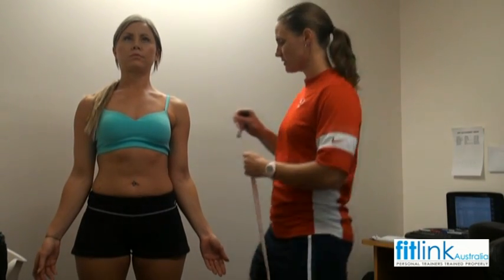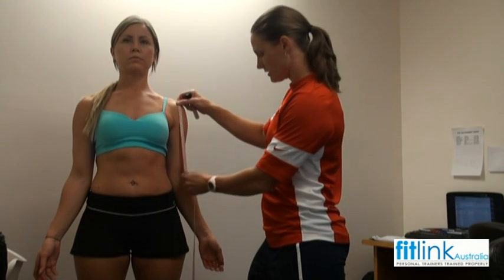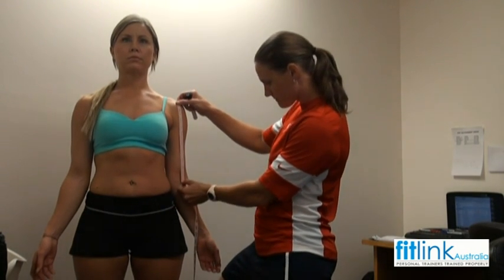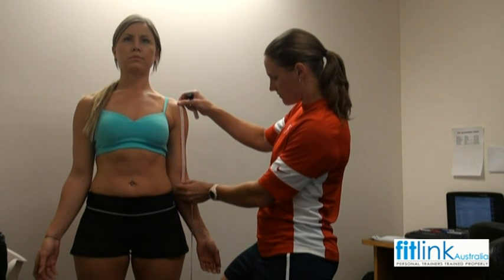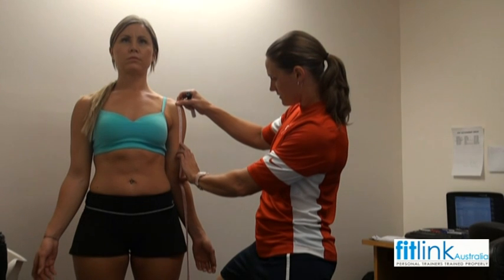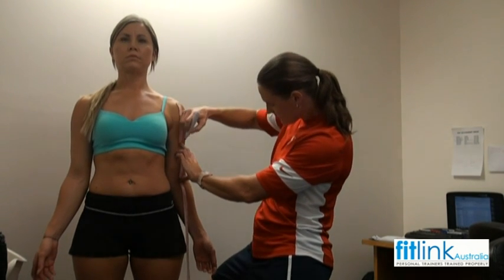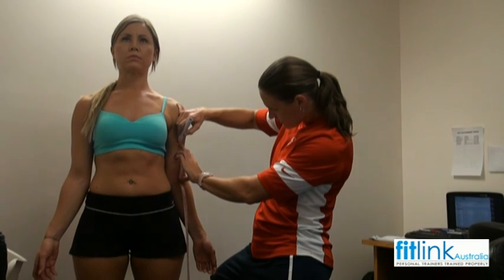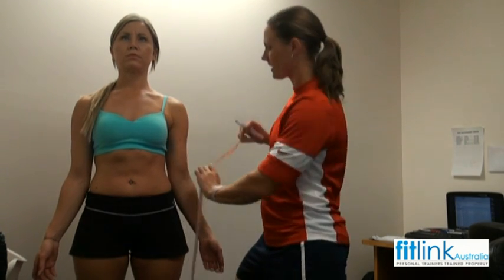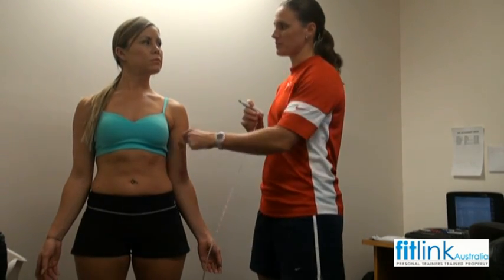I'm just going to measure your bicep to start with. Taking a measurement from the top of the shoulder down the front of your forearm, and then measuring halfway. So 31 — 15 and a half. I'm just going to place a mark. The reason I'm doing that is so that every time I come back and mark you, that spot's going to be the same.